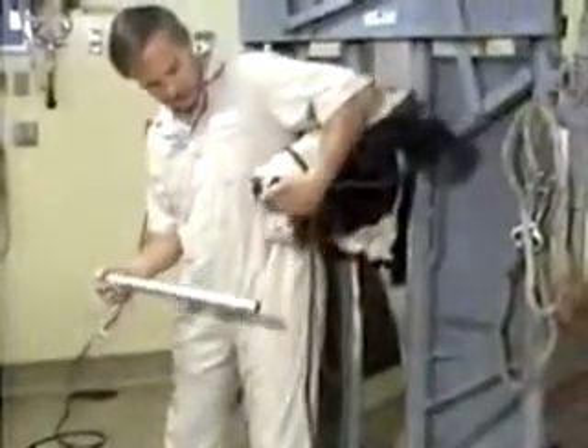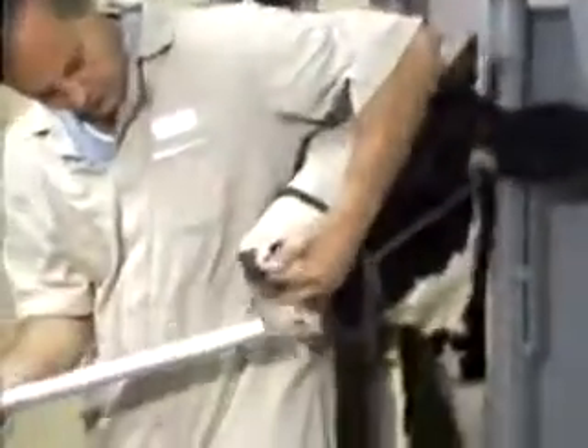We'll insert the Frick tube into the oral cavity, making sure that the halter rope is loose enough so the heifer can open her mouth wide enough. We'll guide the Frick tube back into the pharynx by directing it between the arcades, and then hold onto it with this rope.